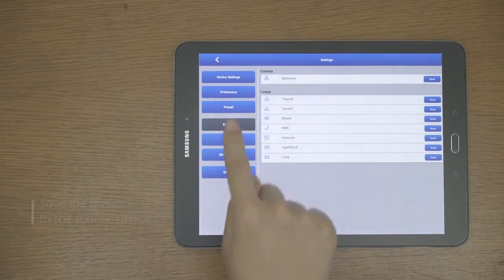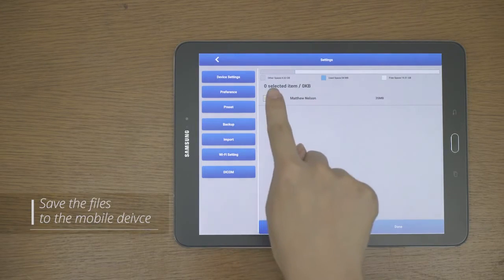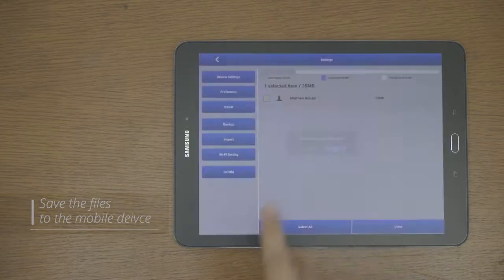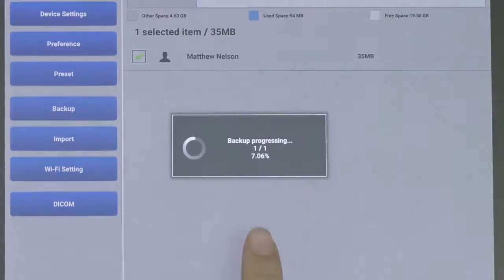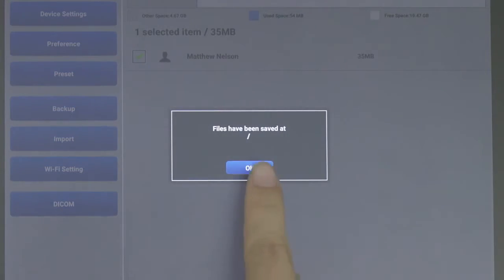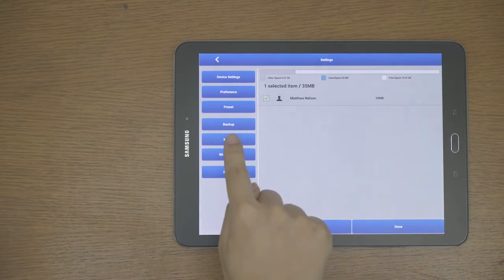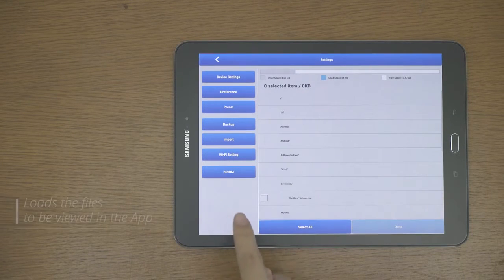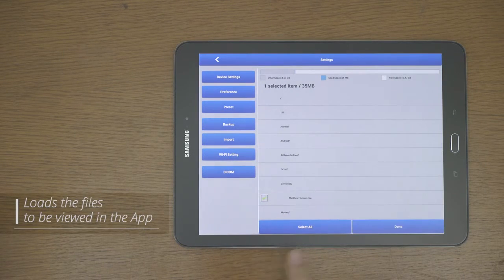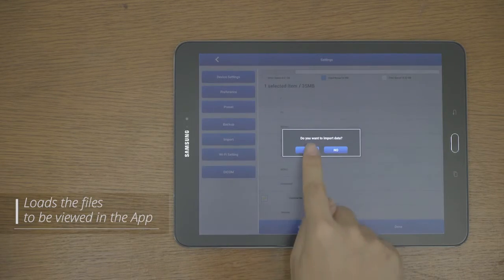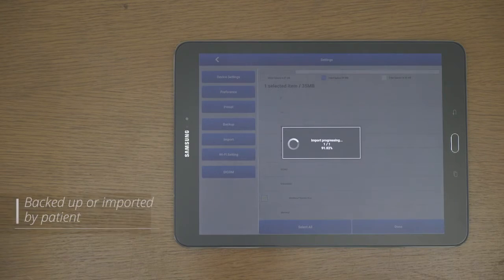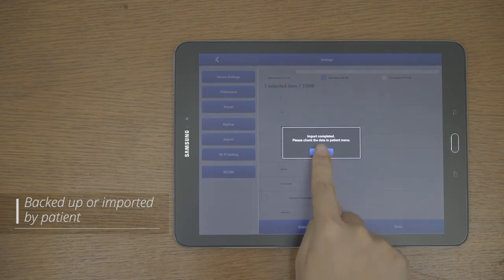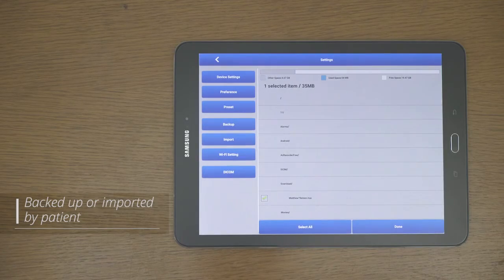Backup is the function that saves the files stored in the Sonon app to the mobile device storage. And import is a function that loads the files stored on the tablet into the Sonon app to be viewed in the app. It can be backed up or imported by patient that are saved with HCA extension.